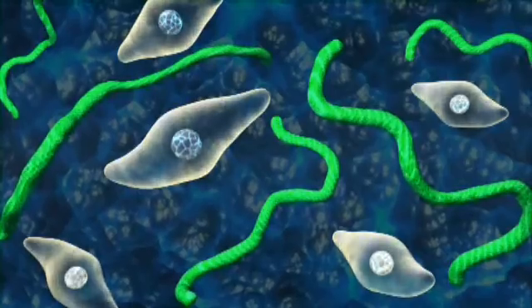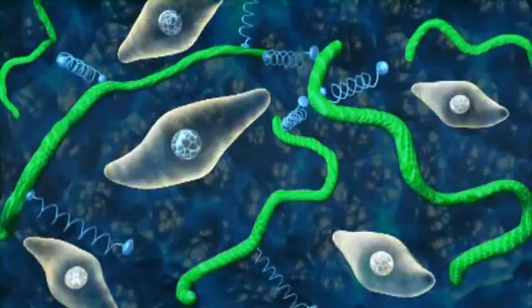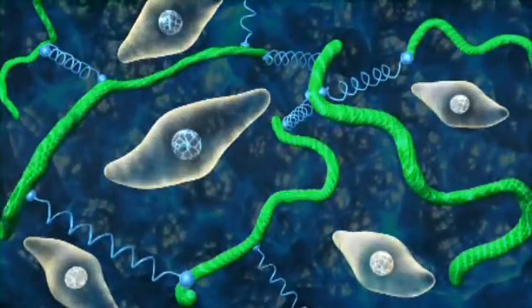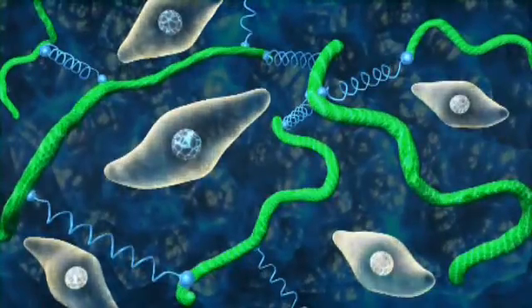Using patented chemistry, hyaluronate and gelatin are cross-linked together to form a biocompatible hydrogel that supports cell attachment and growth of a wide variety of cell types.